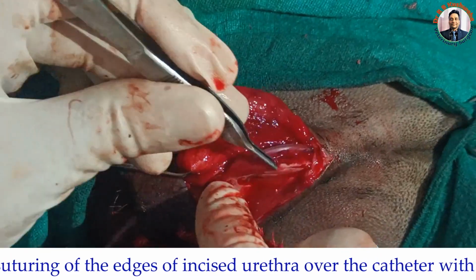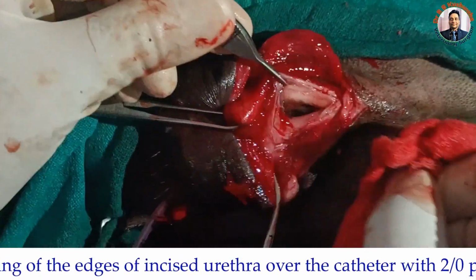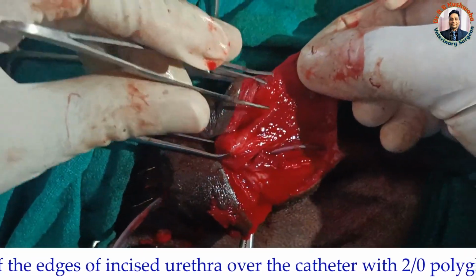So after uniting, I will reflect back the whole glans penis. Okay. So similarly, I could also make the incision here deeper.